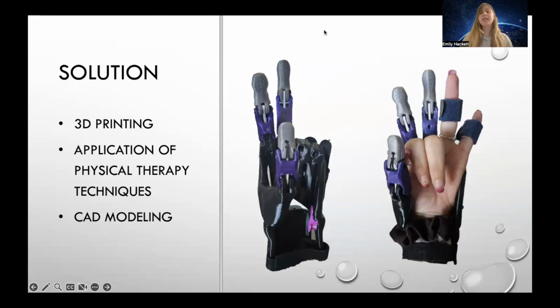By increasing its strength, it increases the flexibility and mobility of the fingers. Furthermore, by stretching the tendon outside of physical therapy, one unconsciously flexes their fingers more in an effort to try to keep them at their normal resting, relaxed pace. This extra mobility helps exercise the fingers and also acts as strength training.